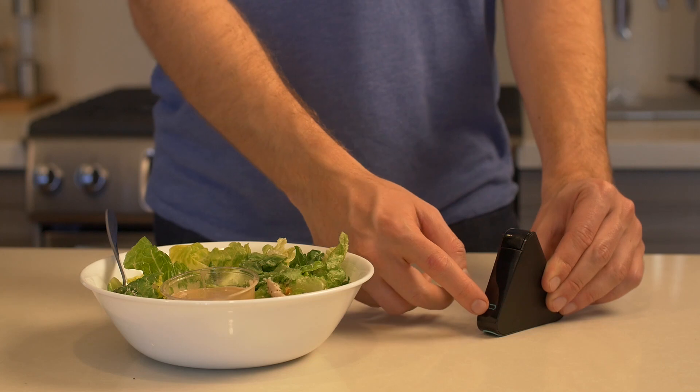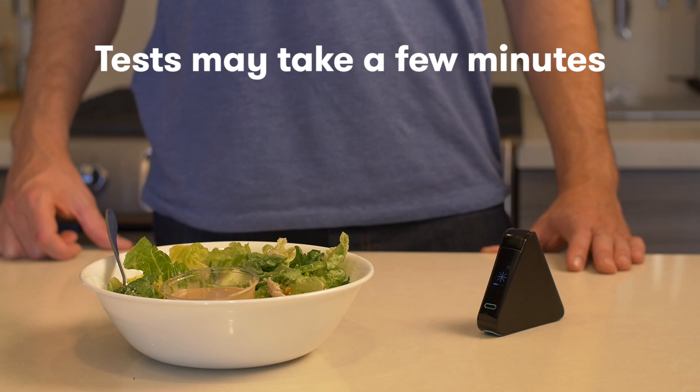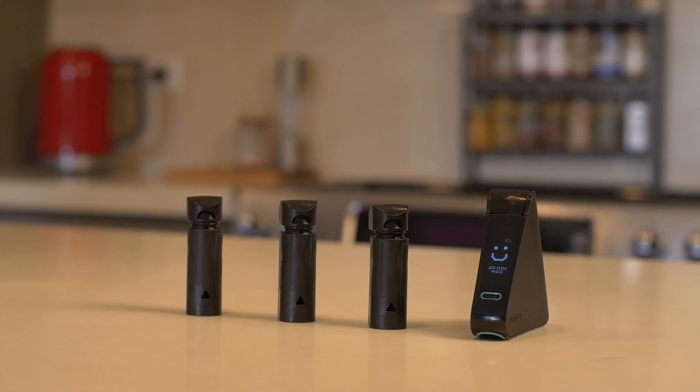Turn NEMA on, press start, and your test will begin. The test will take a few minutes. You'll see the screen thinking, might hear it working, and then you'll see a smiley face if it's gluten-free.